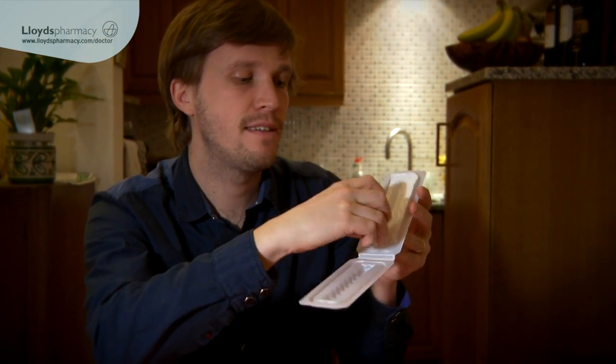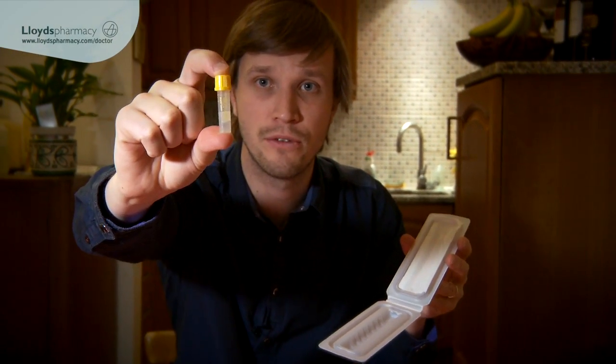So the blood collection bottle comes in a protective case. As you can see it's only a tiny bottle, so we're not going to need a lot of blood hopefully.